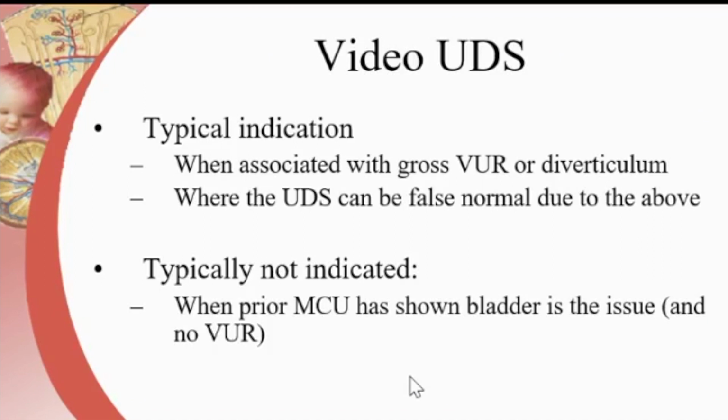A typical indication for a video urodynamic is when you have an associated vesicoureteric reflux or bladder diverticulum, or there is a lot of leakage. The urodynamics can be falsely normal due to these reasons.